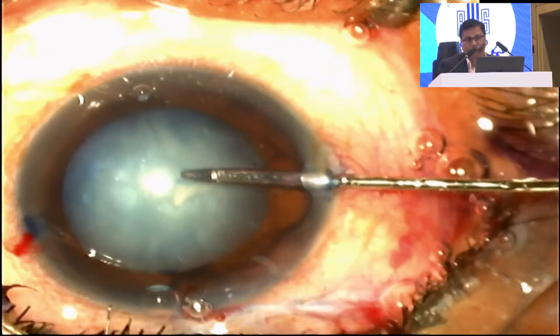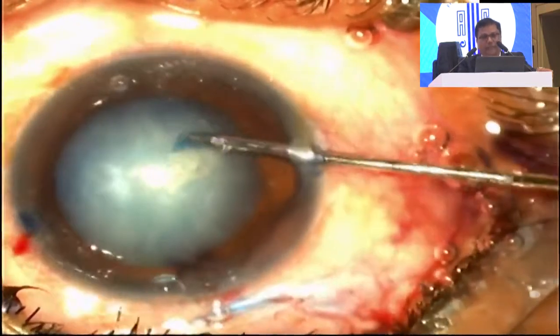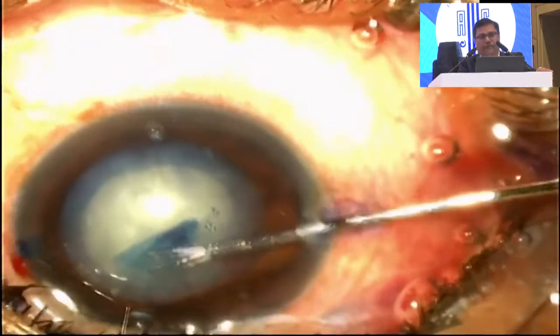Now, I have just mentioned that the microrhexis forceps is important, that we have to use in our day-to-day practice also. We have the microrhexis forceps. We have started doing, and here overconfidence and maybe the speed.